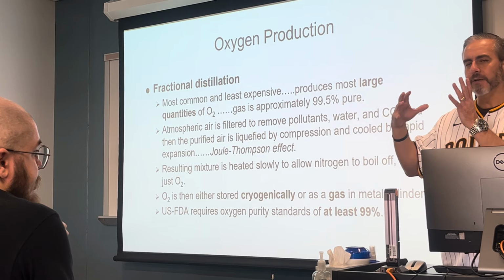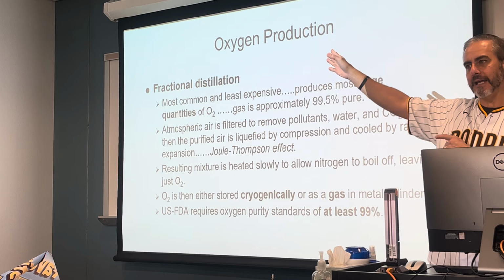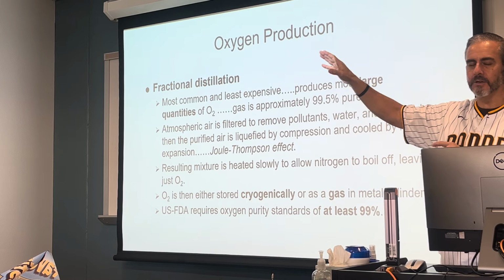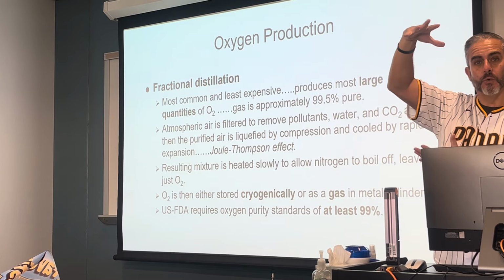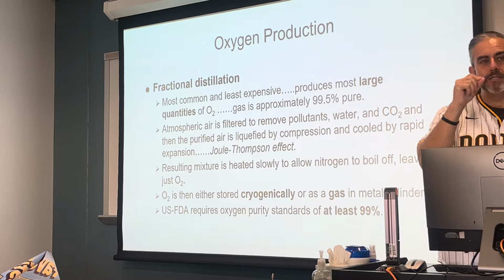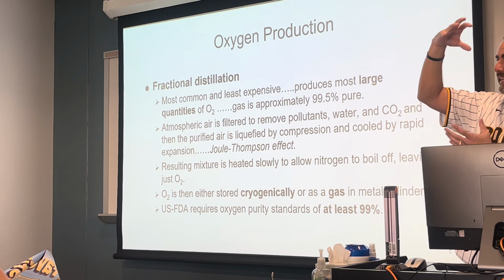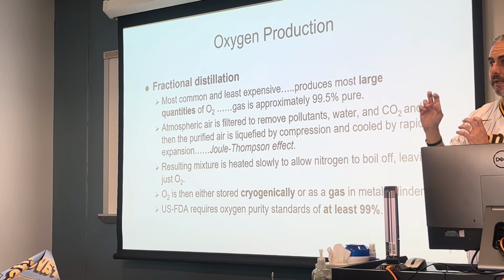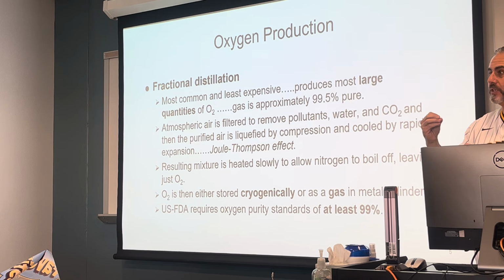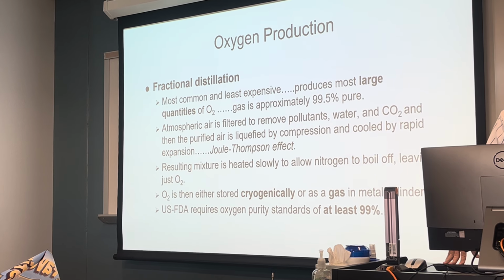We'll get into this, I think, in the second part, but I'm maybe jumping ahead. If you look outside the hospital, every time I get up onto 295 here to go home and I look back at the Baptist freestanding ER, I can't help but notice their tank just off the building that they store their liquid oxygen in. Every single large hospital is going to have liquid O2 stored in a tank outside. Again, it's stored as a liquid. We allow the temperature to rise, that liquid turns into a gas, and that's what goes through the hospital piped-in oxygen that we connect to when we plug in our flow meter, when we plug in our equipment.